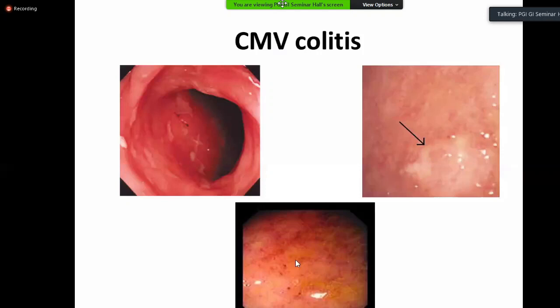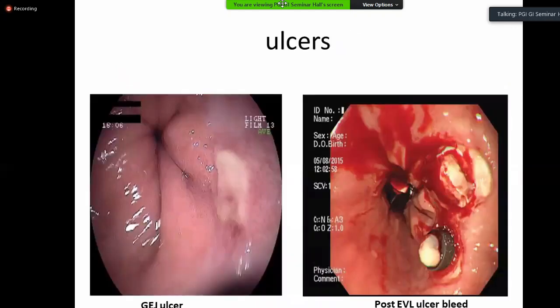So you define the exact lesion rather than saying multiple ulcers seen in the colon. So the description should be full. How many ulcers? Approximately, adjoining areas, distant lesion, skip areas. So all the findings have to be reported.